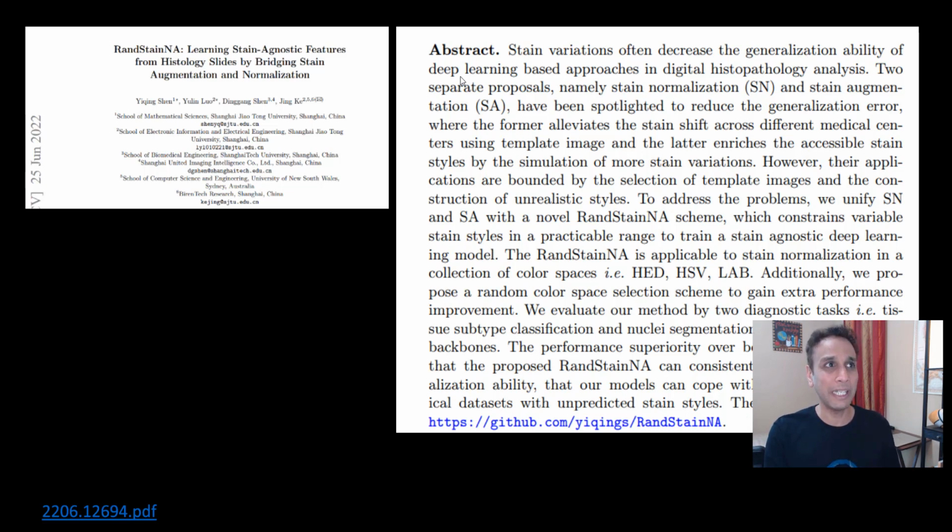So for the ability of deep learning in digital histopathology, and so on. To address the problems, they unify the stain normalization and stain augmentation, these two processes. It's not just normalization. So think of the previous video and add stain augmentation to this one.